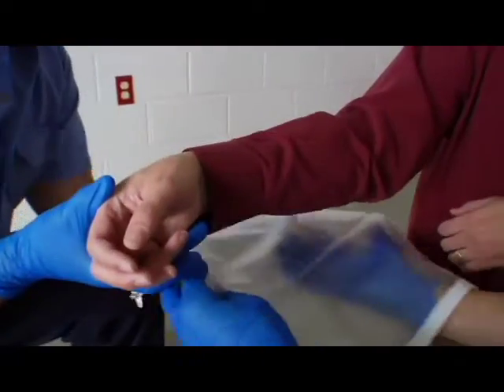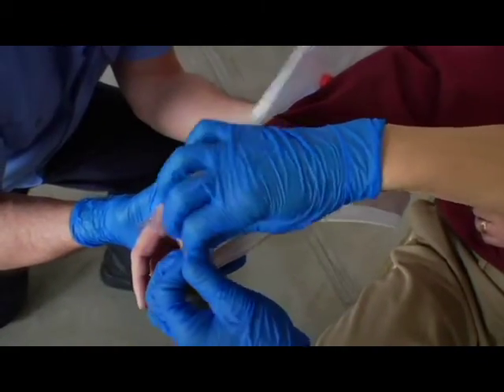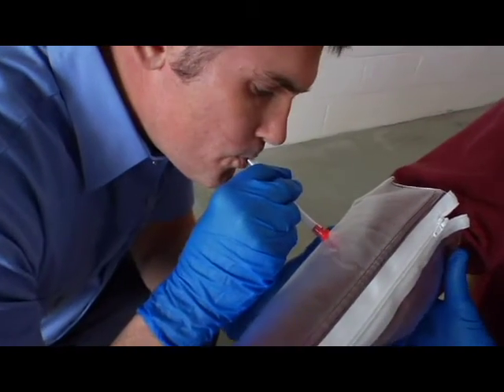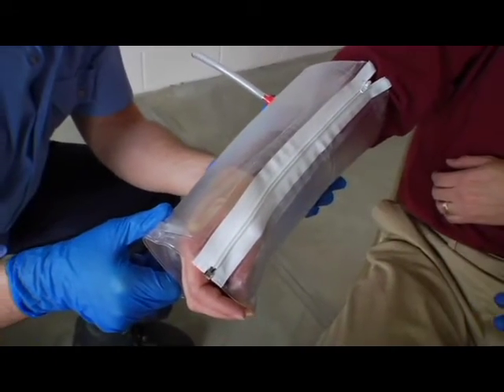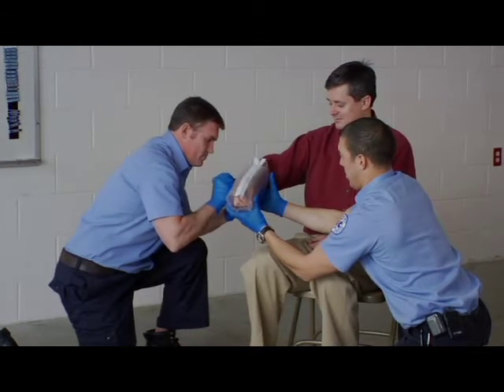Open the splint zipper and gently slide the splint onto the injured extremity using care to minimize movement. Close the zipper smoothly and carefully, avoiding snags or sudden movement. Pull outward on the valve stem to open, then inflate with lung pressure only. Do not use mechanical or compressed air to inflate. Push the valve stem in to close. Monitor the patient's condition before, during, and after application for changes to the injured area.